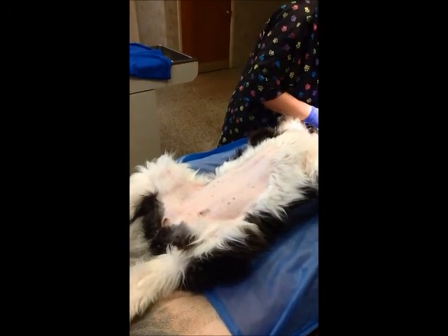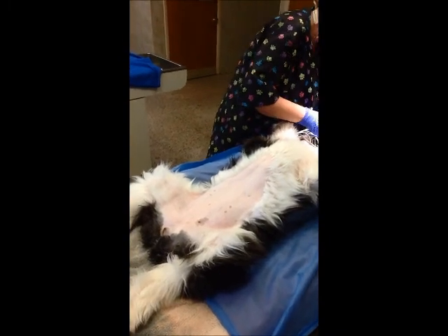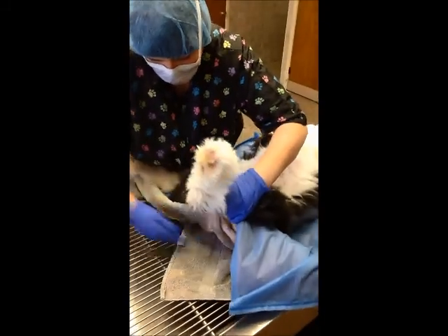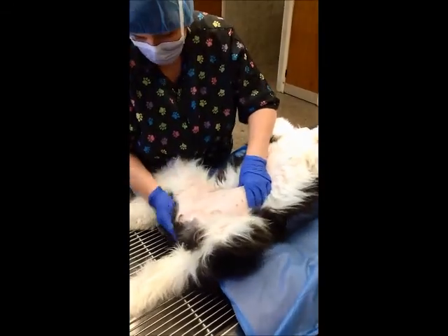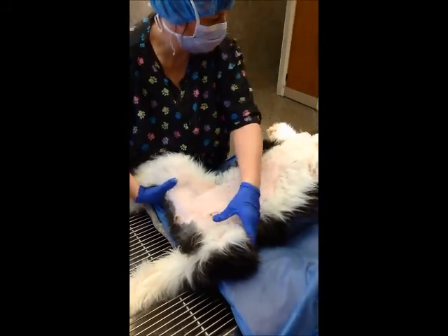See, something always goes wrong. Just hold her tooth for a minute. I'm just going to pull it down.